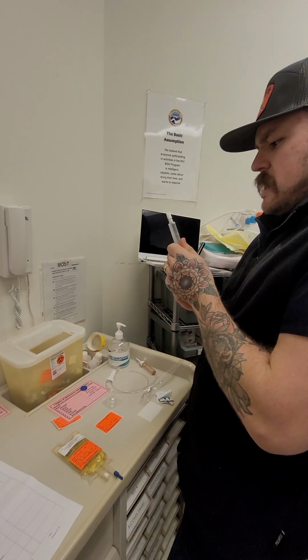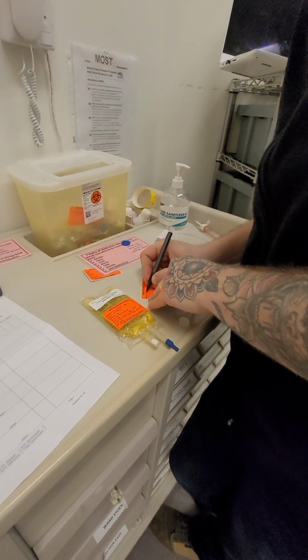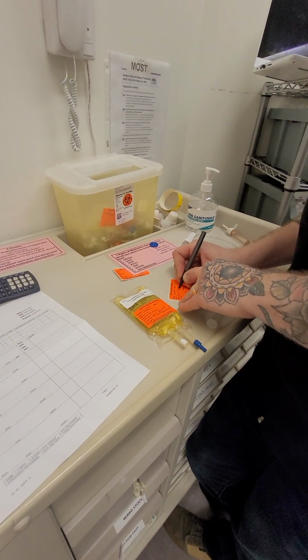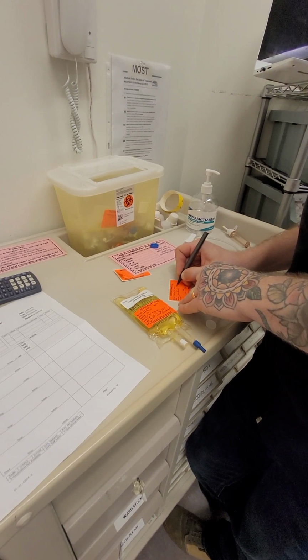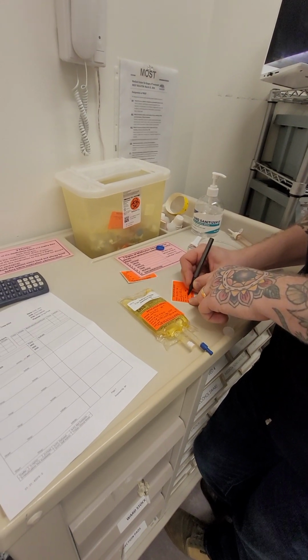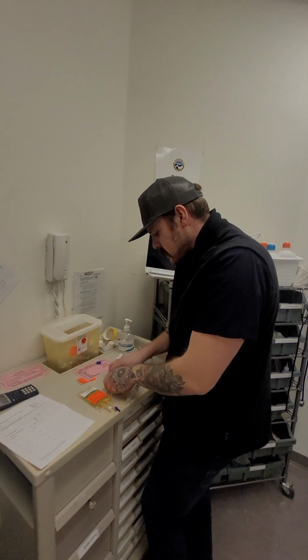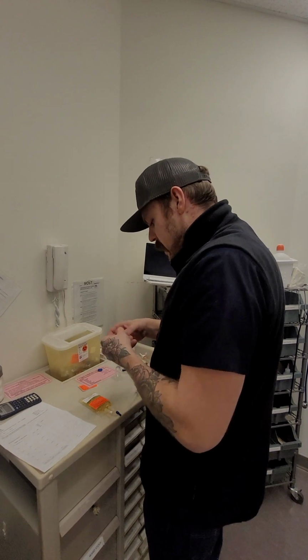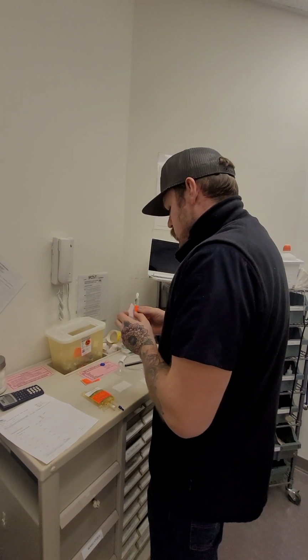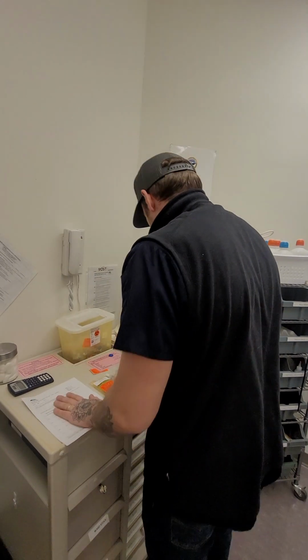And because I'm giving it, I'm going to have to create a label. So we're just going to put the same information. So generic. This is just normal saline. Room 3, amount, we'll leave that blank. Today's date, February, start time, 8 o'clock. Perfect. So I'm going to go ahead and put that on here just because we are giving it into a person intravenously, so we need to make sure that it's not confused with something else. Put that on there. Okay, so we've got our medication, we've got our flush, we've got our MAR.